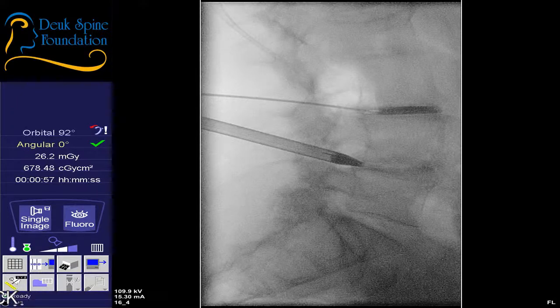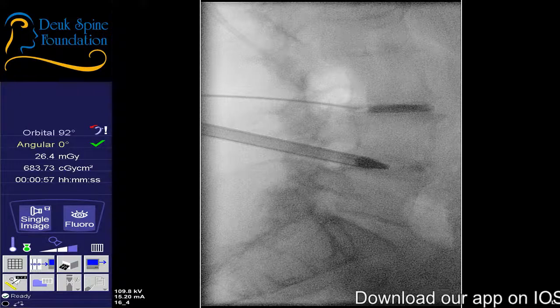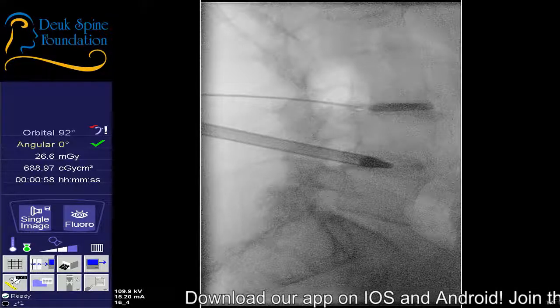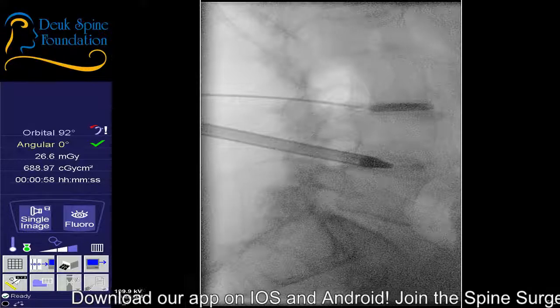And this is where your experience comes in. You have to visualize and feel that you're doing the right thing. Now, if you don't do this right, you could fracture the bone. You could end up in places you don't want to be. Places that could cause serious harm to the patient.